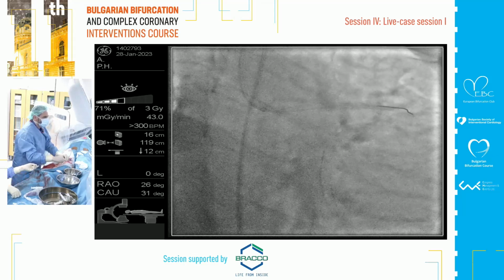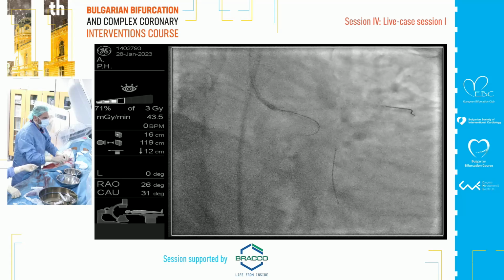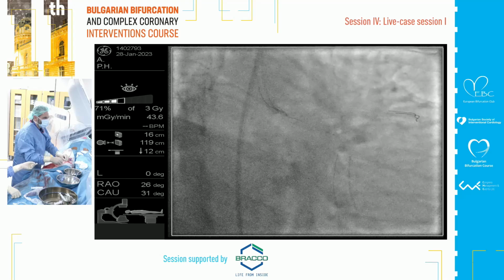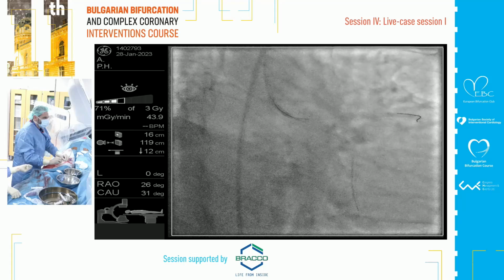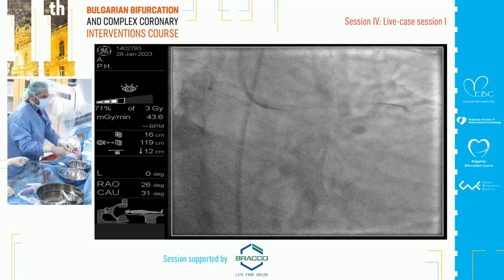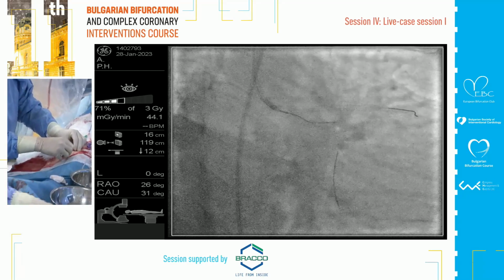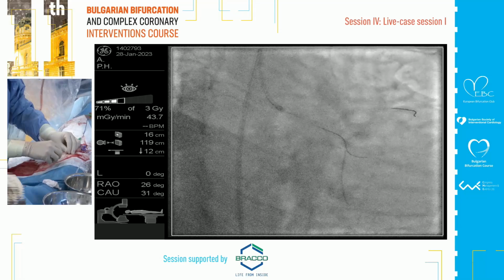Let me ask you, Valerie, did you use the IVUS to mark the ostium? Because you can use the IVUS in a fixed projection and take a cine. No, we haven't used IVUS. We wanted to make the work on the bifurcation of the left main. No, I meant before you stent, to know where the ostium is, you can use the IVUS to identify the ostium.